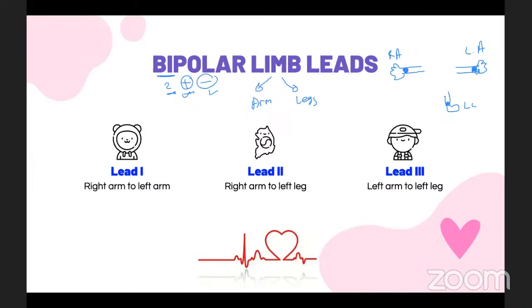What we need to know today with the bipolar limb leads is that, okay. Before we get to this part, I'm going to ask you a question. Is the heart placed on the right side of most people or on the left side of most people? Like, where is it located?